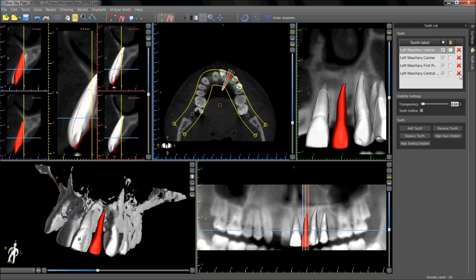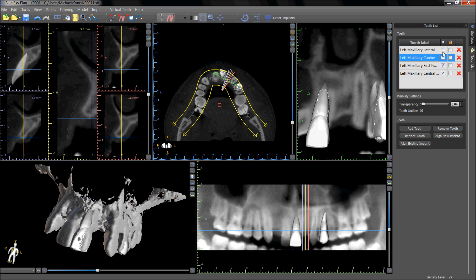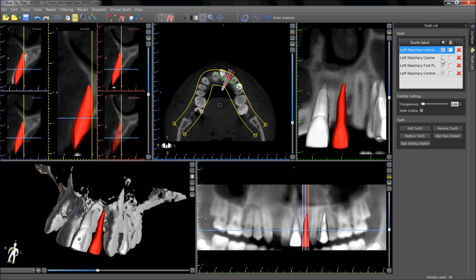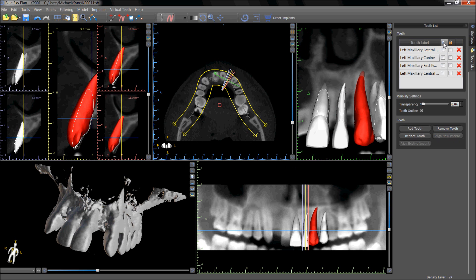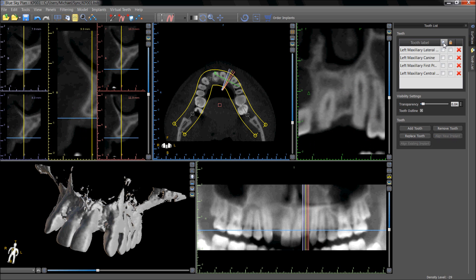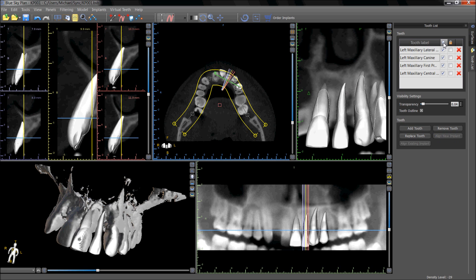A virtual tooth can be deleted by clicking on the red X next to the relevant tooth name in the tooth list. Virtual teeth can be hidden and unhidden by unchecking the checkboxes, or by clicking on the tooth icon above the column to hide and unhide all the virtual teeth at the same time.